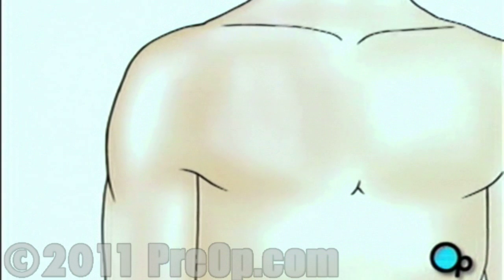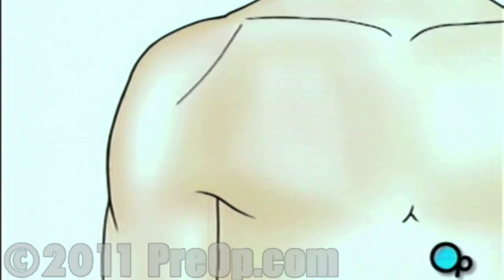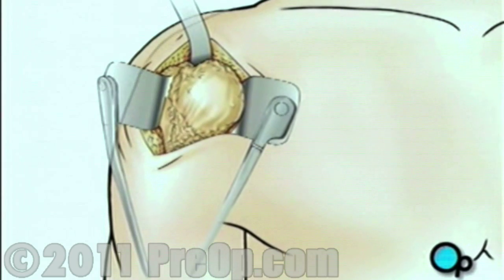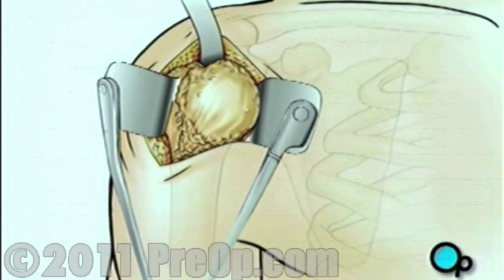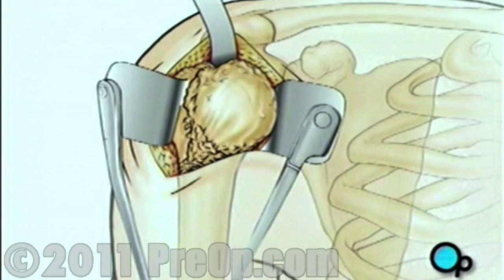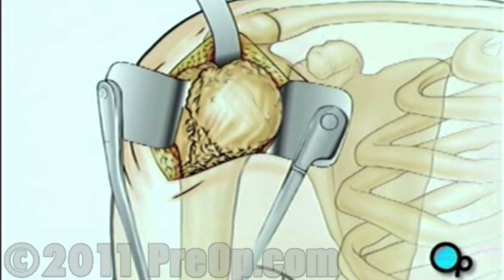Then, when you are asleep, the surgical team will make an incision over the shoulder. The team will pull the skin aside to reveal the muscle tissue below. They'll then make another incision to reveal the shoulder joint. Next, the team pulls the top of the arm bone out of the shoulder socket. Using a precision surgical saw, your doctor will carefully remove the ball-shaped end of the upper arm.